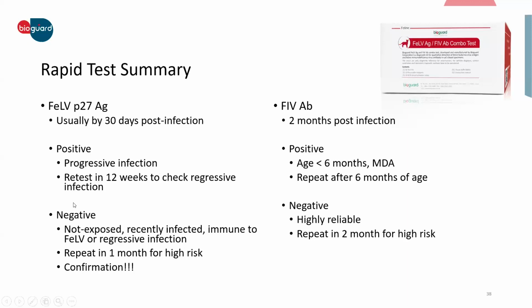If it's negative, it means the cat is not exposed, or it's recently infected and the P27 protein is still not detectable, or maybe it's a regressive infection.